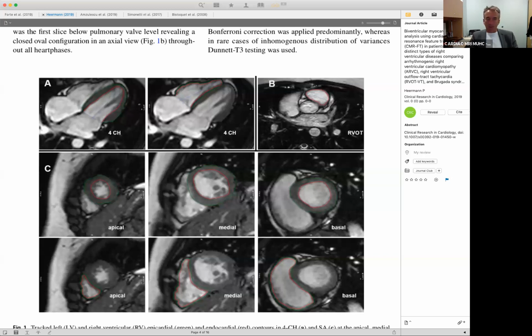and problems of the right ventricle. I don't see that right now. I think with the left ventricle, we're almost there. But even with the left ventricle, we need to train systems with more data so that we can get really reliable contours. And even if there is a mistake somewhere in the contours, it will hopefully be a systematic error, so that the reproducibility would still be good, and also the comparison between software. So what we need is huge data banks with contours that are used by all the different software providers to generate their machine learning based algorithms. So that would be mine.